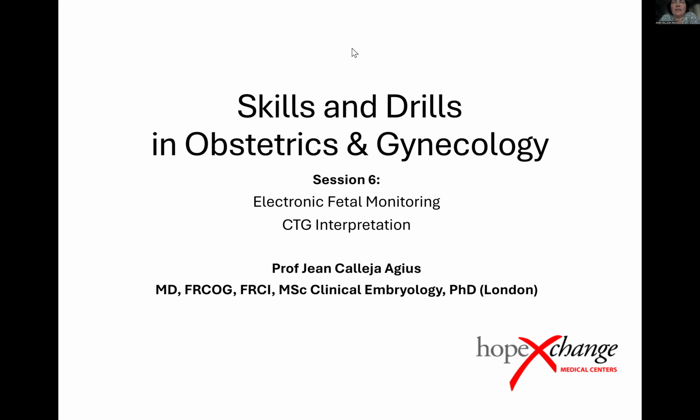The idea is that there is a more or less standardized way of how to interpret CTGs, so that in times of stress, in times of emergency, it goes kind of in your subconscious. And if there is that standardized interpretation, the risk of misinterpretation or mismanagement is reduced.